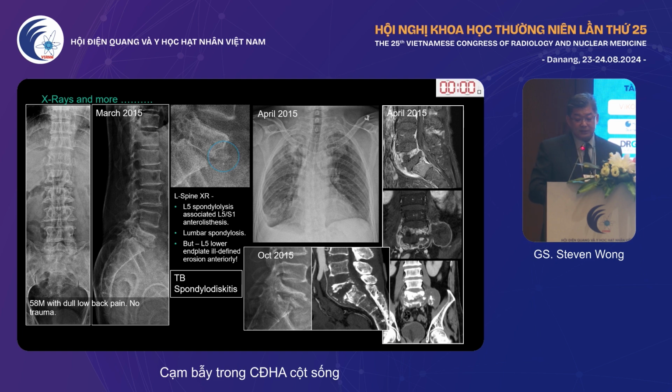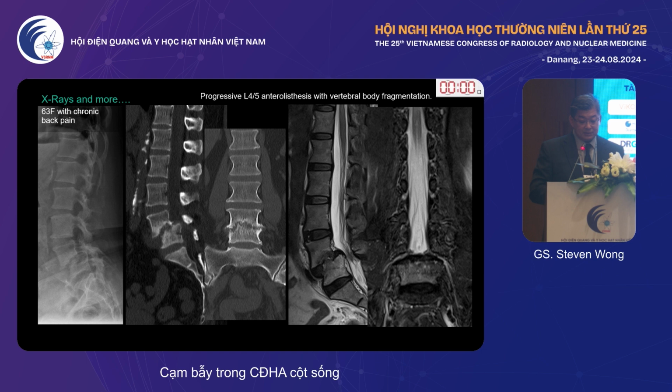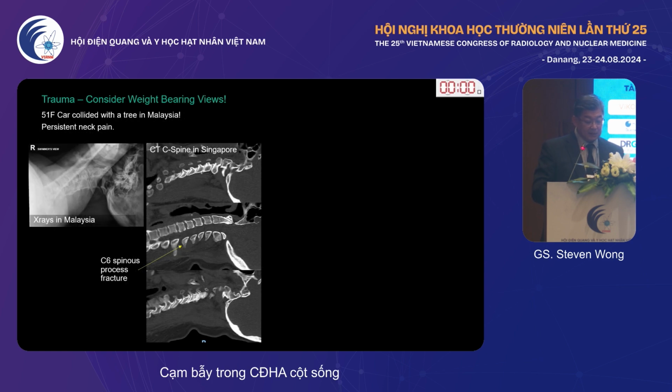Okay, so infection, another 2 more minutes and I'll finish. So we saw this one earlier where if you do additional studies and reformats, you will see the infection in the disc spaces better. Okay, so for trauma, consider weight-bearing views.